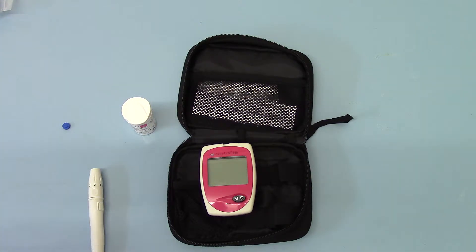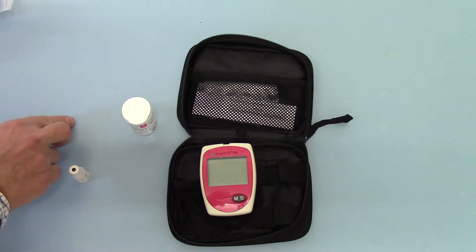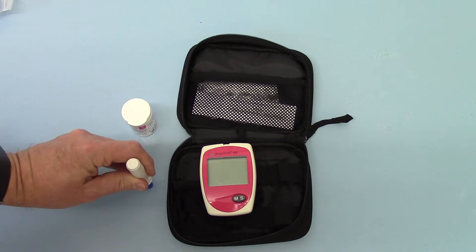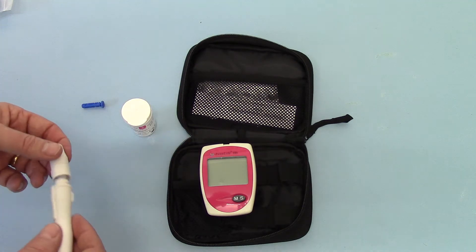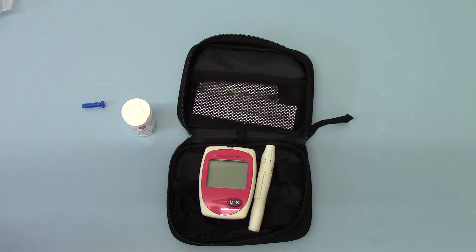That is the correct procedure for getting an accurate haemoglobin reading from a capillary blood sample. When you are done with the lancet, remove the cover and push the lancet down into the plastic cover on the side. That covers the element of the lancet quite safely and it can be disposed of. Put the cover back on the lancet device. You can preload a lancet into it, but to keep them sterile until the point of use, it's best to load the lancet just before you're ready to take the next sample.